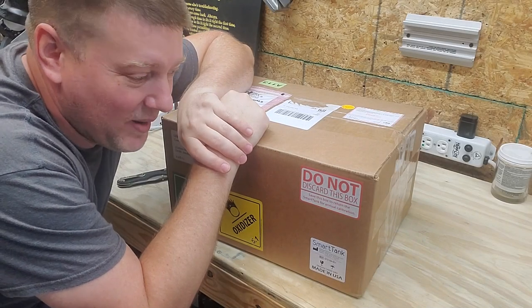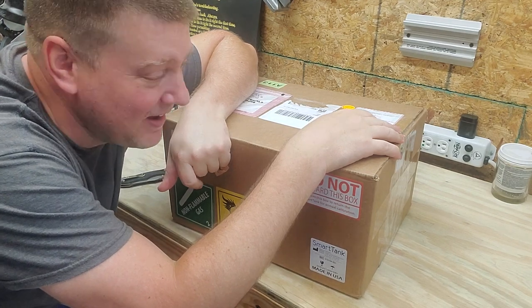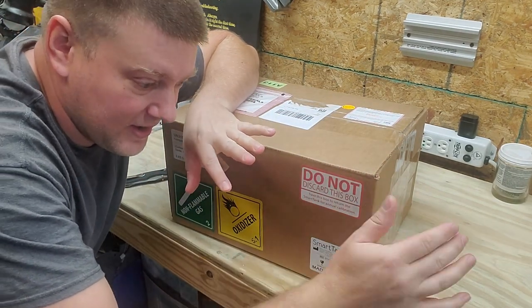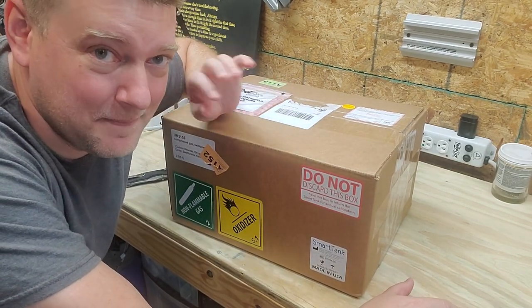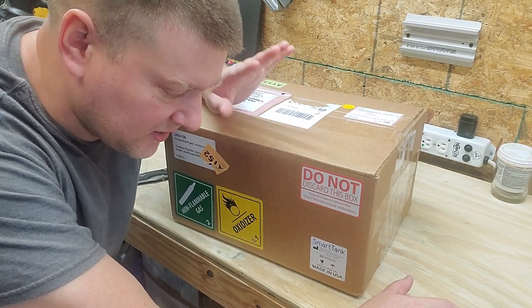Hey everyone, welcome back to Better Biomed. I got a very special box in the mail today. I've been so excited about this item for months and now I finally got my hands on it. This is the Smart Tank, and there's not too many of them in circulation yet in the continental United States.